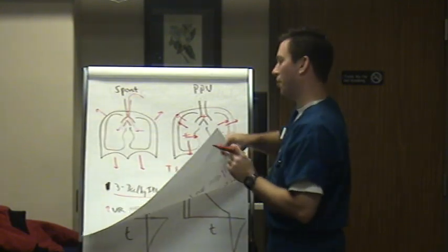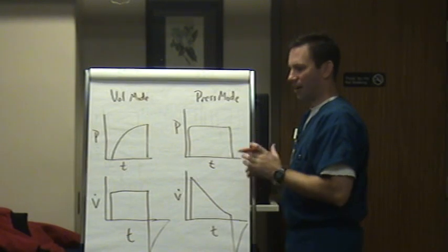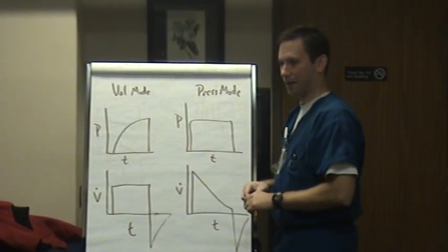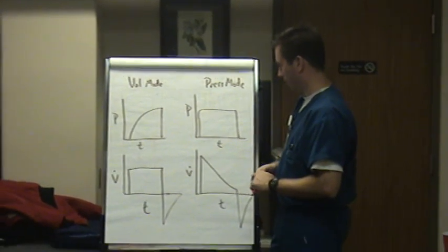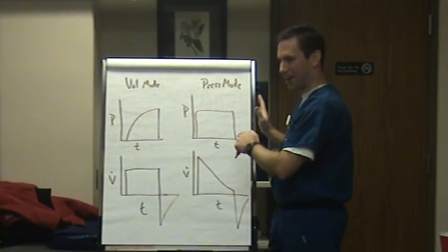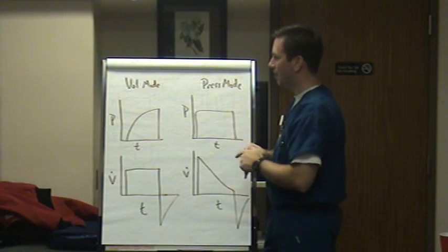A lot of people say, oh, he's got a pulmonary problem, you know, let's intubate him and fix it. But you cannot separate the pulmonary problem from the cardiac issue, because you're going to embarrass cardiac function to a certain degree. So, slide 1. Anytime I talk about a vent change from here on out, remember, okay, we need to recheck and make sure that the patient's heart likes it.